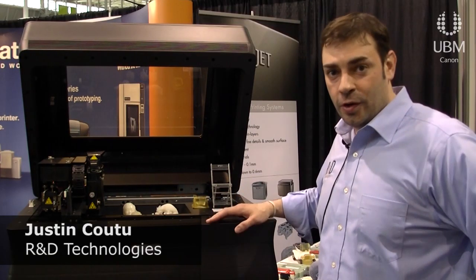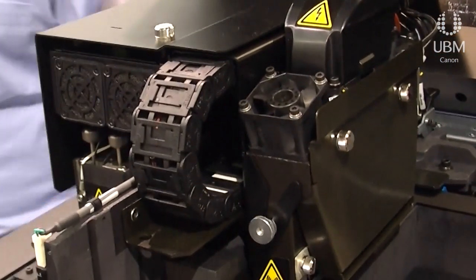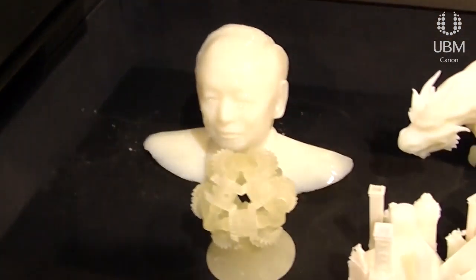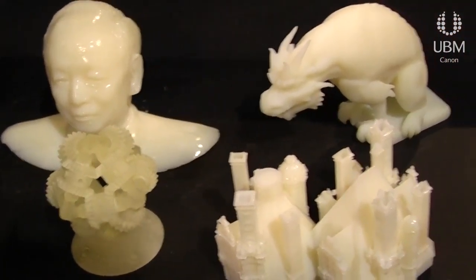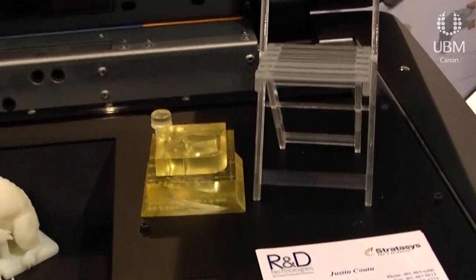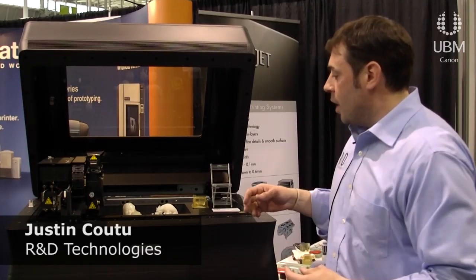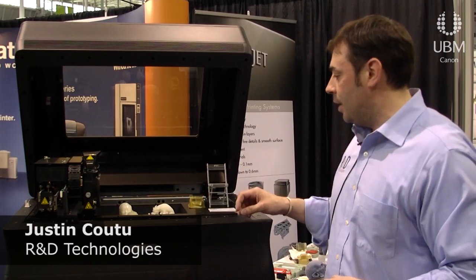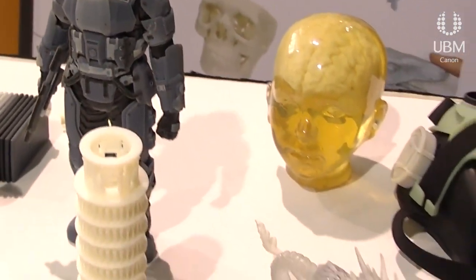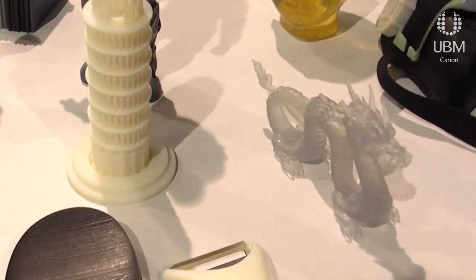What we have here is our Object 30 desktop machine. Our 3D printing process takes liquid photopolymer and jets it into pixels — the exact geometry of your designs. It fills in any open geometries with support material. The models built on this tray can be anywhere from 12 by 8 to 6 inches tall, and it cures as it rolls back and forth with UV light, which is what gives you an acrylic part when it's done.